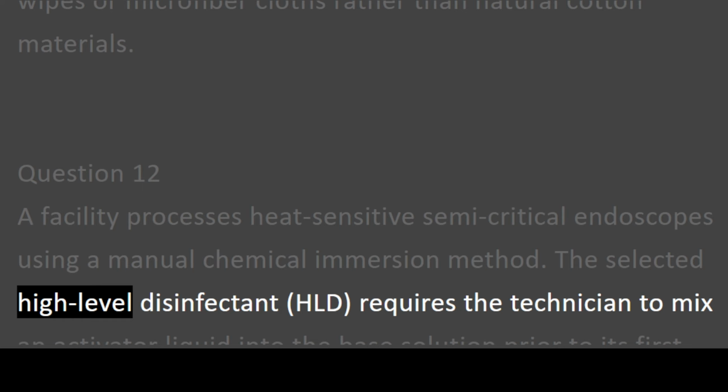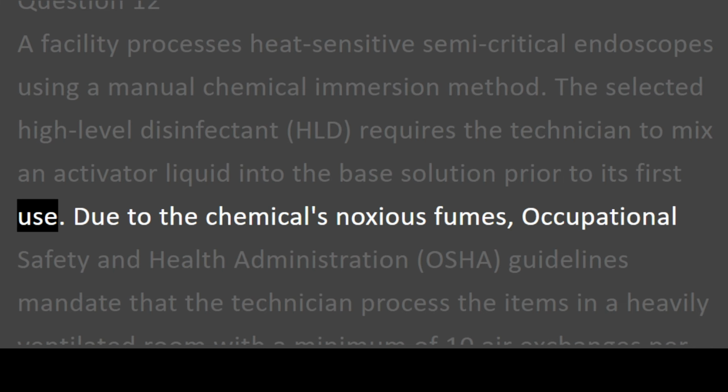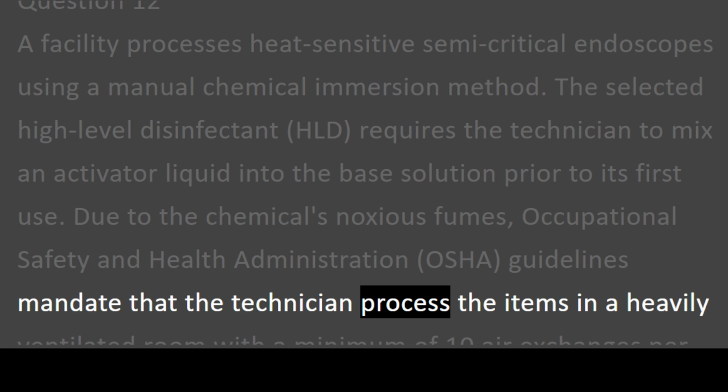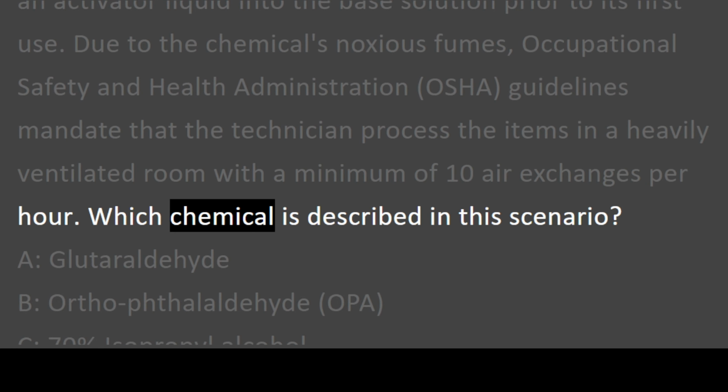The selected high-level disinfectant, HLD, requires the technician to mix an activator liquid into the base solution prior to its first use. Due to the chemical's noxious fumes, Occupational Safety and Health Administration, OSHA, guidelines mandate that the technician process the items in a heavily ventilated room with a minimum of 10 air exchanges per hour. Which chemical is described in this scenario?